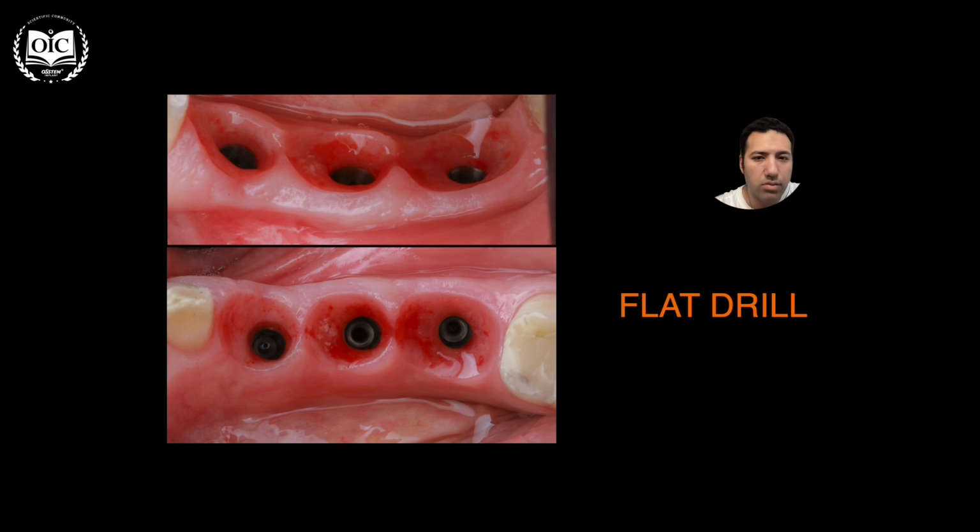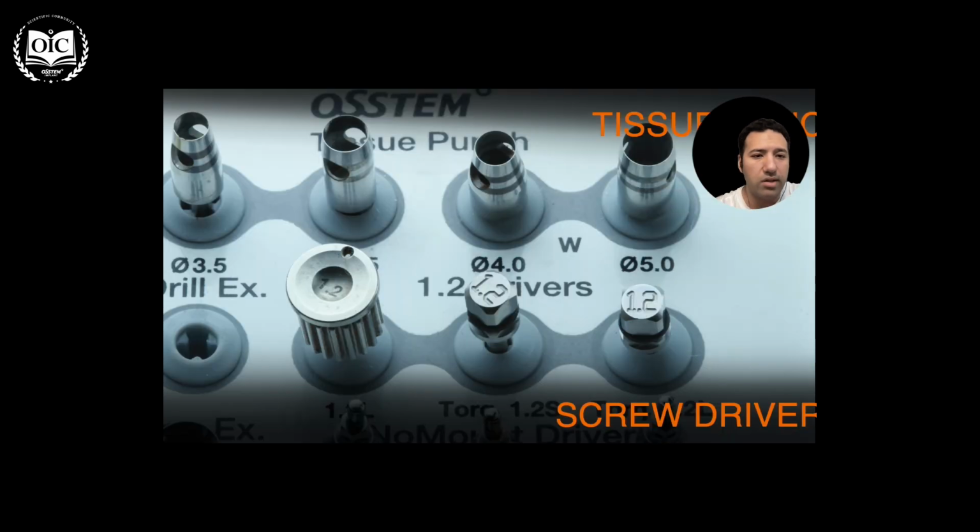This case I've done without any soft tissue or bone graft, just manipulation of the bone anatomy and placing a healing abutment on the day of the surgery, and placement of the crown with perfect tissue contour, as I just mentioned in the previous section. The restorative contour guides the healing of the soft tissue. Then you have this beautiful profile after 1 month of loading.